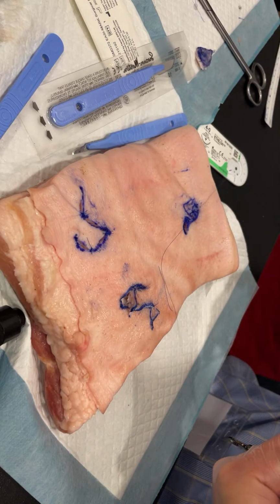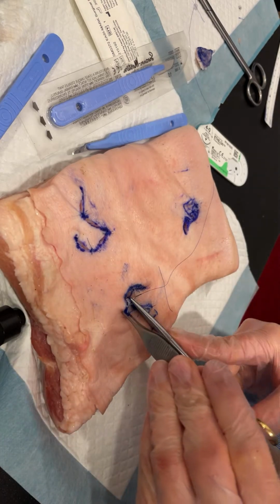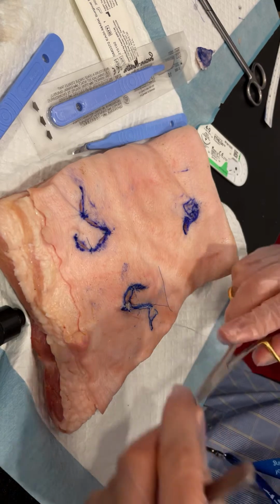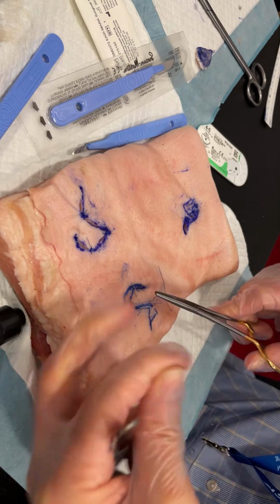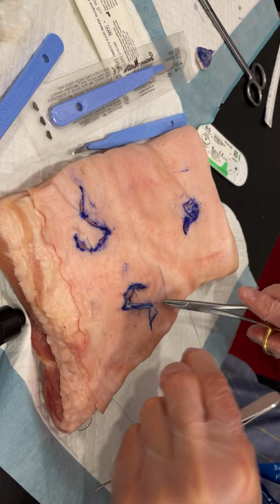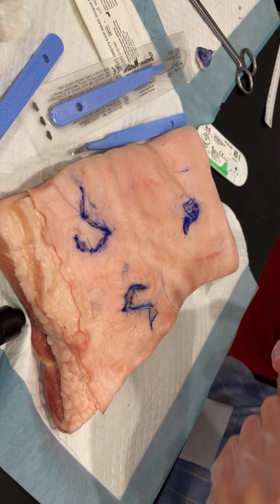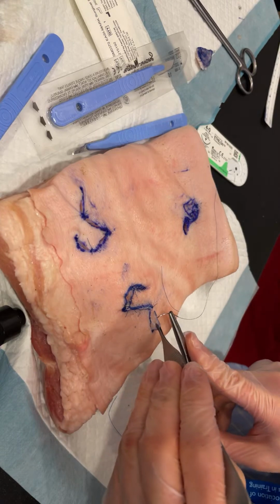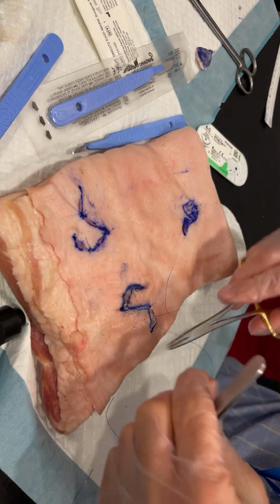Very nice rhomboid. And if you see, the donor side is a certain angle, which is not straight down perpendicular as when I draw it. And you have to remember that whenever you do this flap, because you want this scar to sit in a place hidden away or into a natural crease. So you're not really on the underneath, because actually everything's through here. So, as you see, this is your flap, and then you can put your other stitches underneath to close the whole thing.